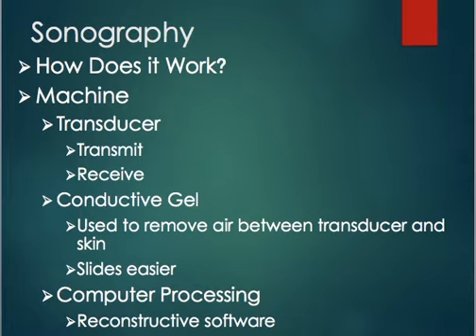So how does sonography work? Well, in the 1960s, the principle of sonar was applied to medical diagnostic imaging for the first time. That's not when sonography was developed. It was originally developed by the Defense Department during World War II. However, we didn't use it in medical imaging until 1960.